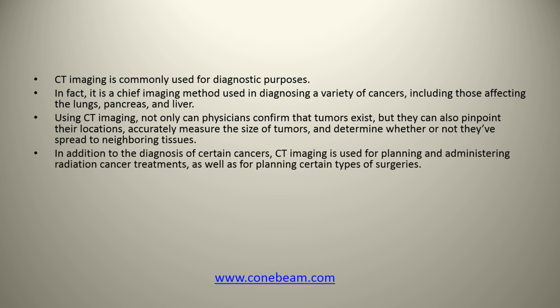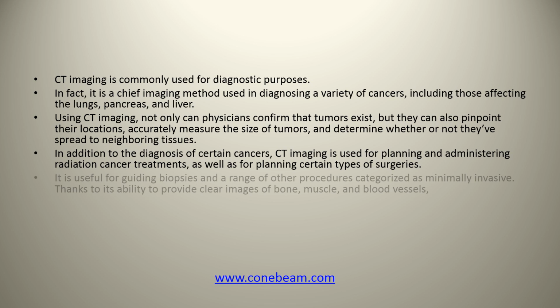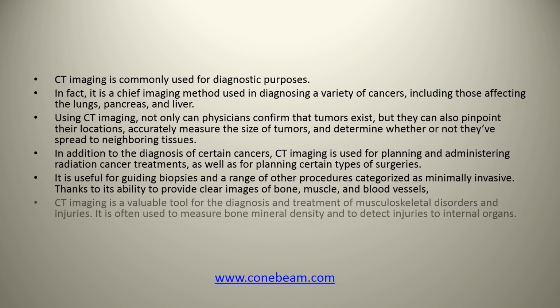In addition to the diagnosis of certain cancers, CT imaging is used for planning and administering radiation cancer treatments, as well as for planning certain types of surgeries. It is useful for guiding biopsies and a range of other procedures categorized as minimally invasive. Thanks to its ability to provide clear images of bone, muscle, and blood vessels, CT imaging is a valuable tool for the diagnosis and treatment of musculoskeletal disorders and injuries.